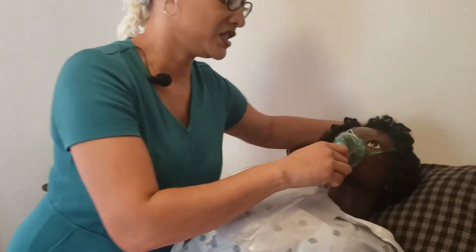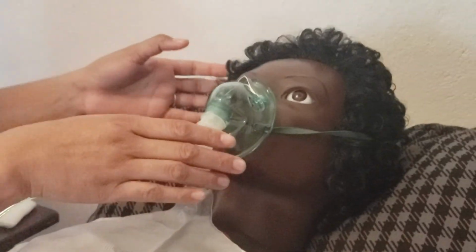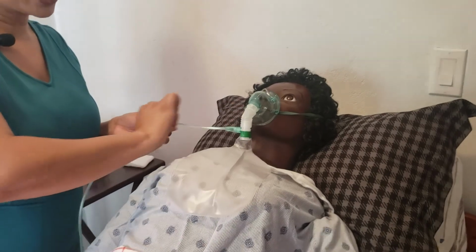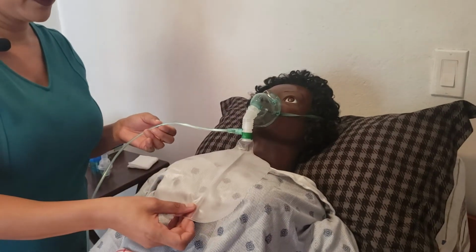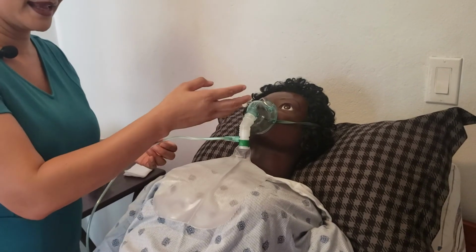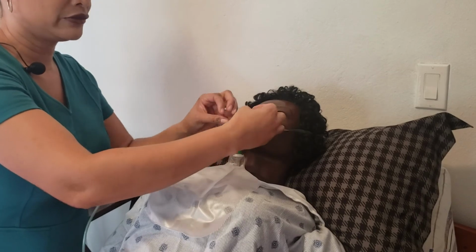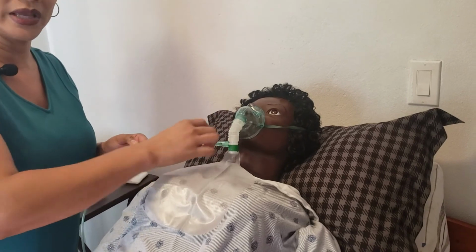So once you've got this bag filled, now you can place it onto the patient's face in a similar manner to what we've done before. So now the patient will be getting air directly from the oxygen source that goes into this bag. When the patient breathes in, the little flap in here is going to raise, the bag is going to deflate, and the patient's going to get pure oxygen from this bag. When the patient breathes out, the little tabs here are going to lift and let out that air, and you're going to see the bag inflate. Why? Because new air comes in.